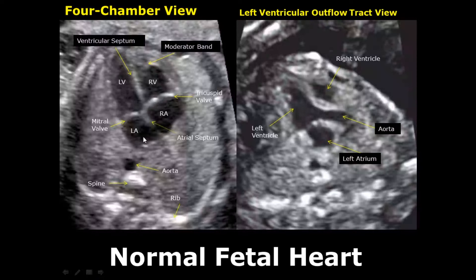Firstly, we will study the fetal heart. The best view to completely see the heart is the four-chamber view, in which we can see all four chambers, the valves, the interventricular septum, the atrial septum, and the foramen ovale. Here is the moderator band in the right ventricle, and this circular anechoic structure is the descending aorta. Always remember the aorta will be very near to the left atrium.